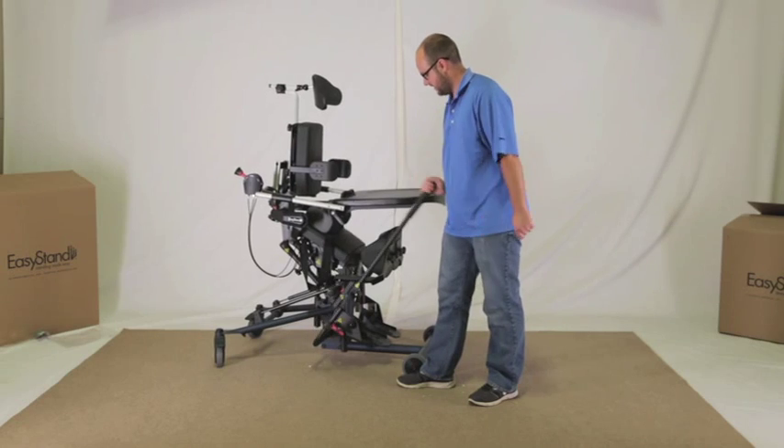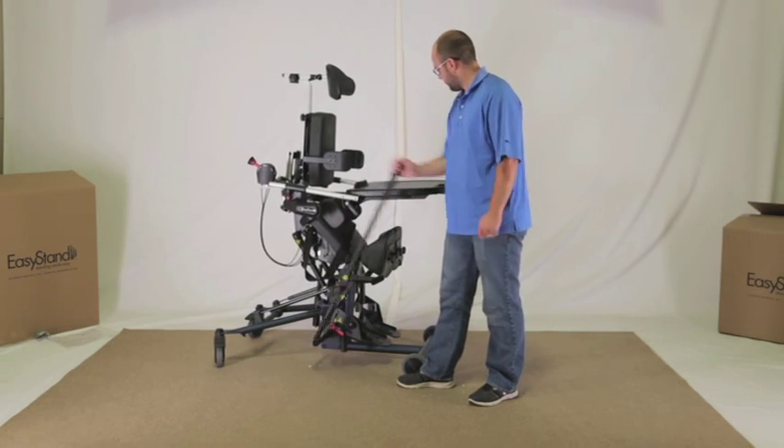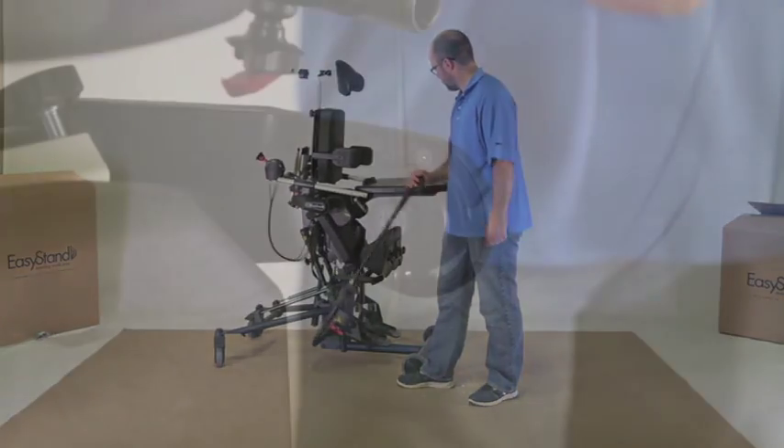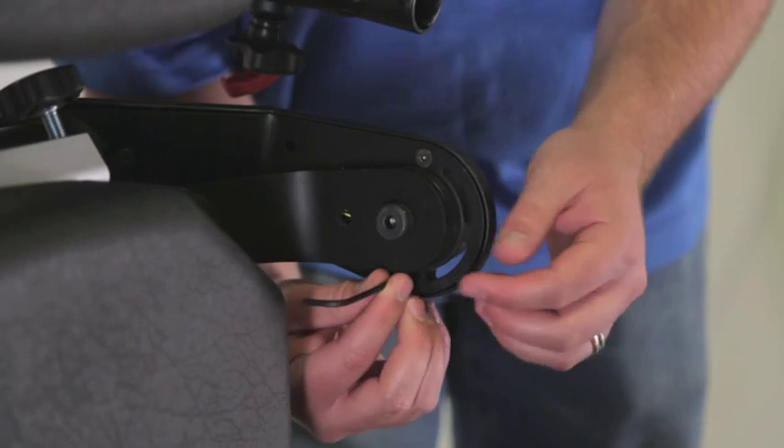Pump the unit up until you have access to the third bolt hole on the hip pivot cover. Insert the bolt and tighten securely. Do the same on the other side.